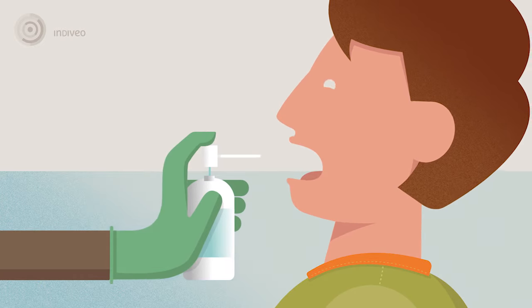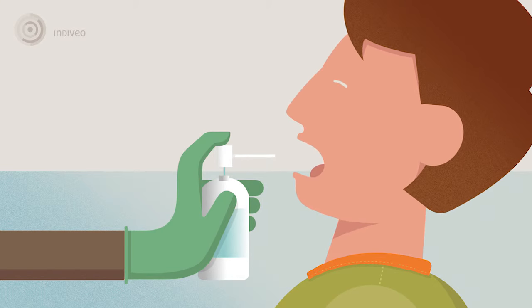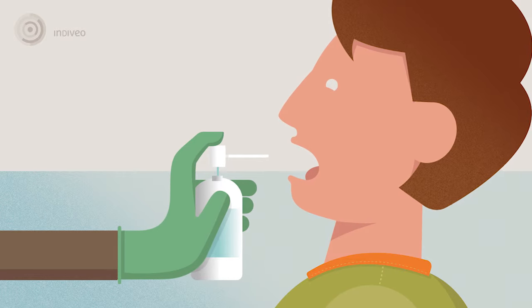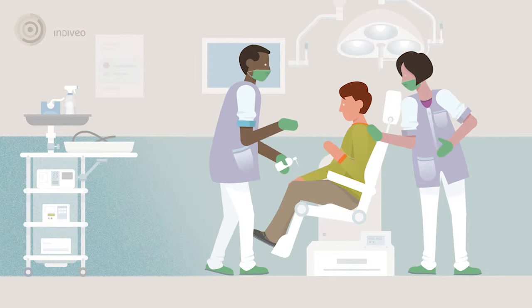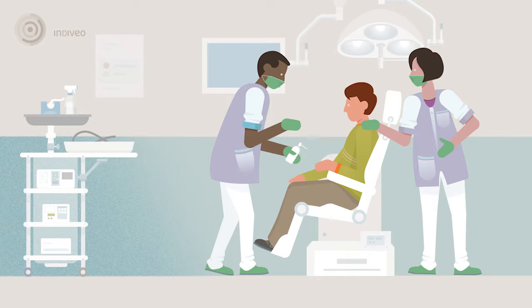Before the procedure begins, the physician or nurse will numb your throat with a local anesthetic spray. Because of the sedation, your throat will start feeling swollen and stiff, and swallowing will become more difficult.